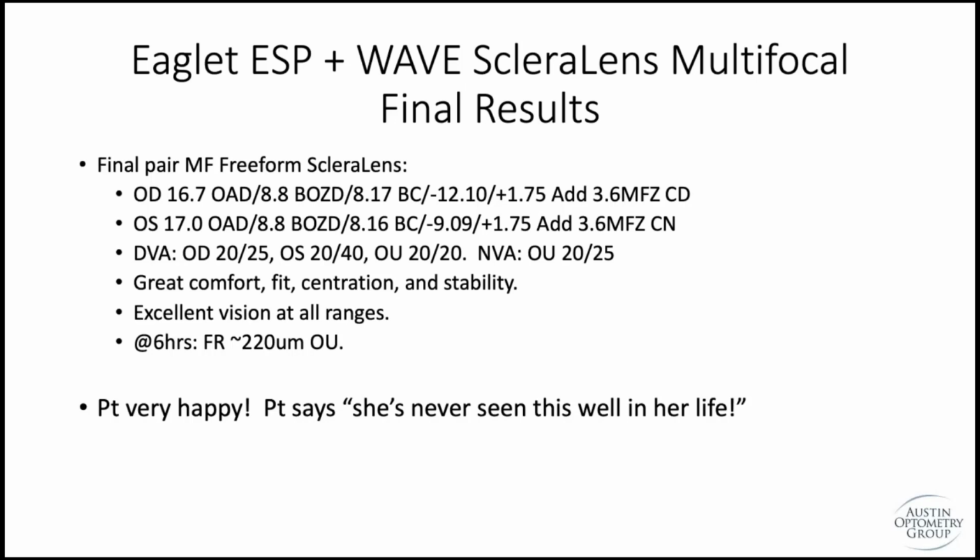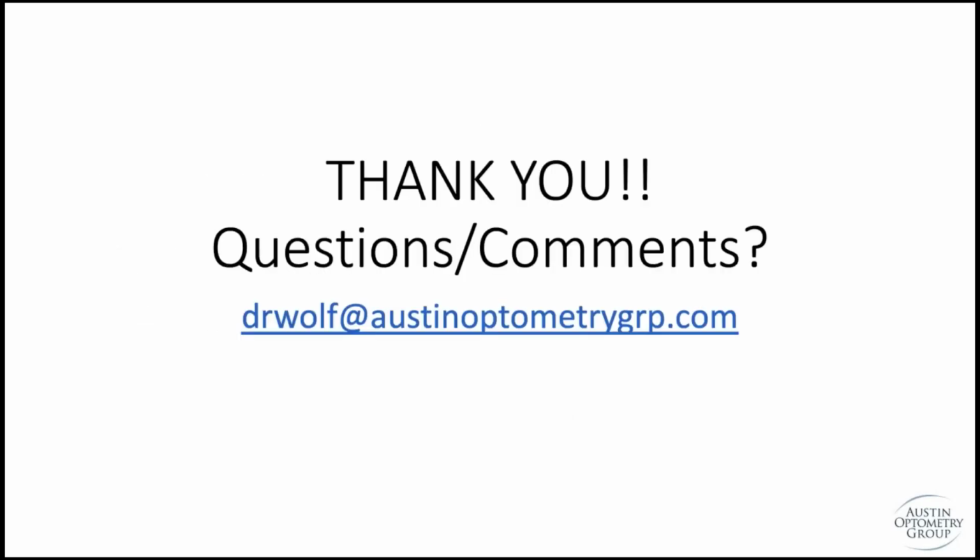So there's almost no time in which you're ever going to do something as small as 20 or 30 microns of sag height on a ScleraLens. But it was kind of fun to see that the software and the lathe are actually doing what you're asking it to do, even as precise as that. So that's all I got.